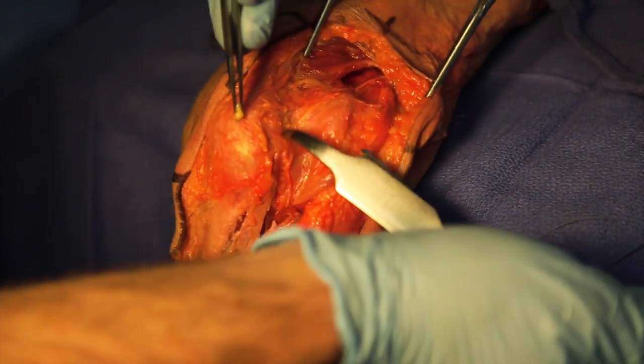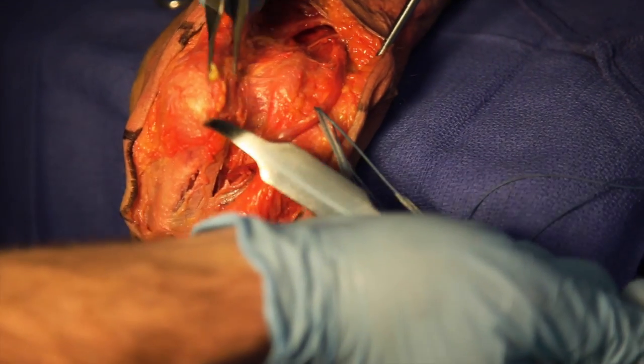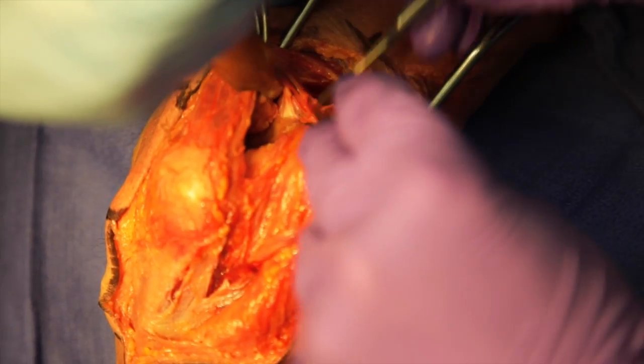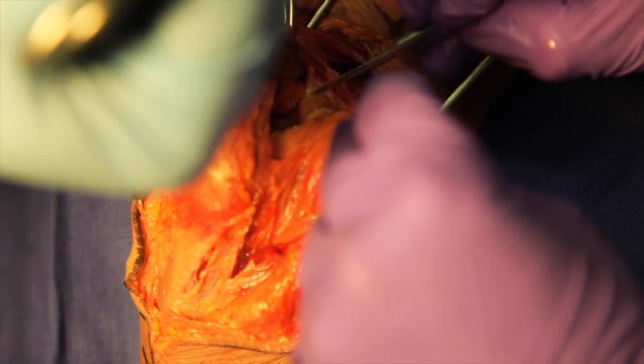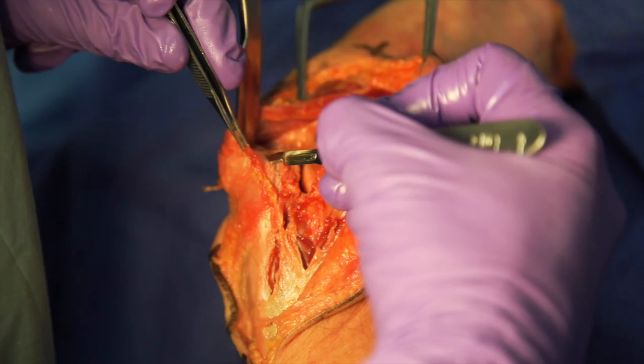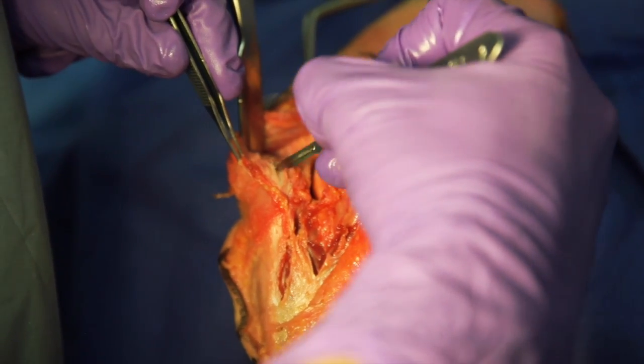After identification of the junction of the triceps and intermuscular septum, it is incised. This incision is carried distally, incising the medial forearm fascia and capsule to expose the joint.